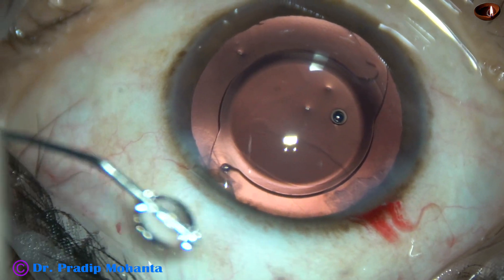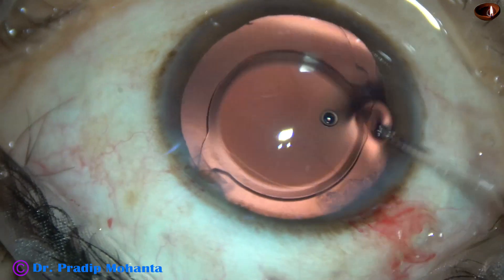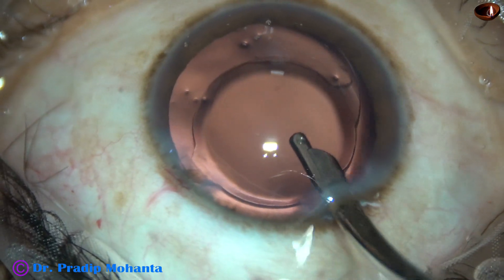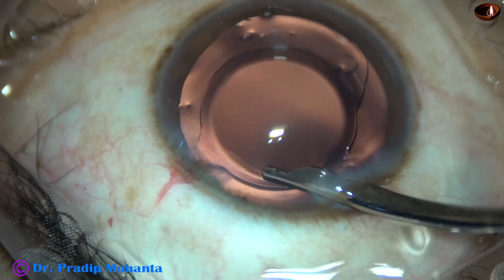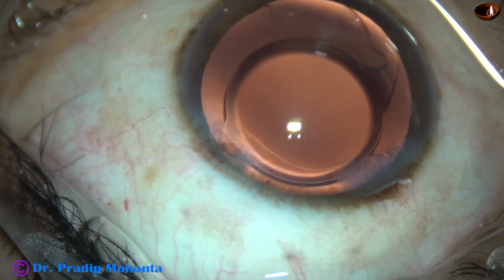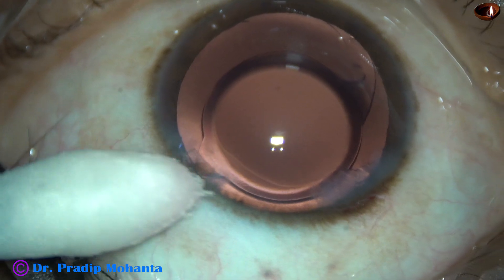The side port is being closed by hydrating the corneal stroma on the other side of the stab wound. Now a final lavage of the anterior chamber: a gentle stream of fluid removes the viscoelastic that sticks to the corneal endothelium. The anterior chamber is nicely formed, the intraocular pressure is kept on the higher side, the integrity of all wounds is checked, and a few drops of Moxifloxacin are applied over the cornea. The case is concluded.